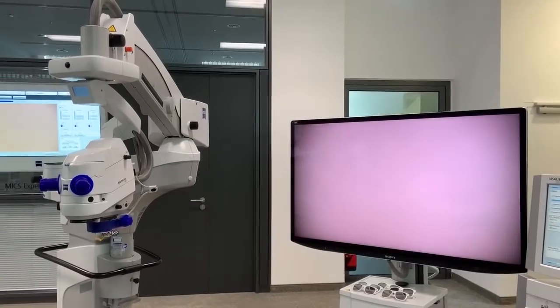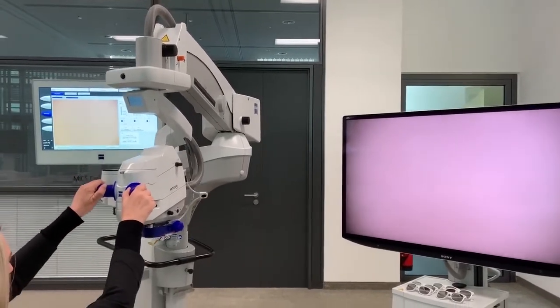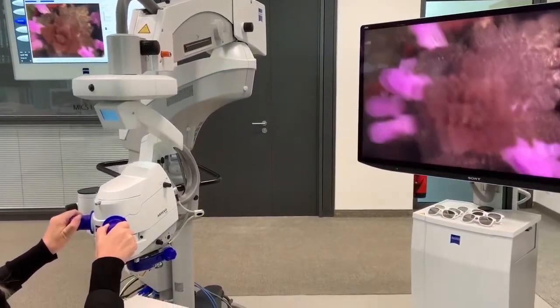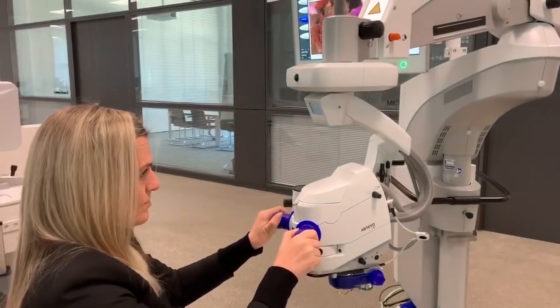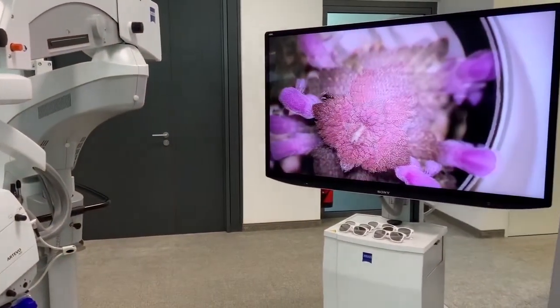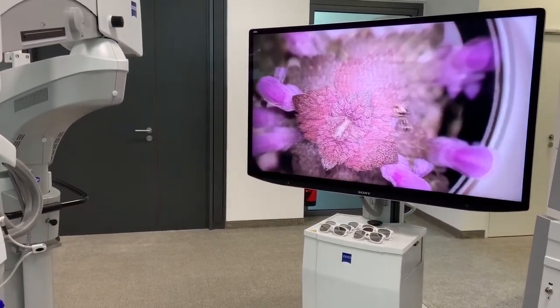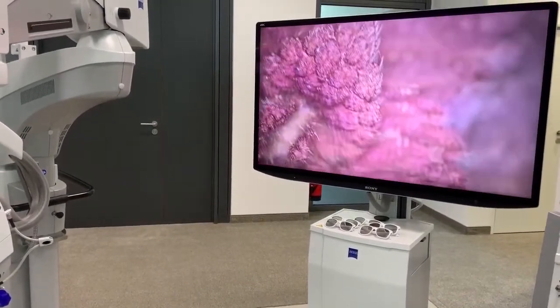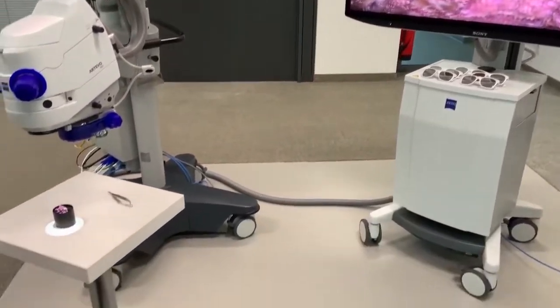As mentioned in the beginning, Artivo 800 is the first digital microscope. It contains the so-called patented digital optics. The new optical concept combined with the two 4K cameras in the microscope head allow you to use less light during surgery and as such increase patient comfort.